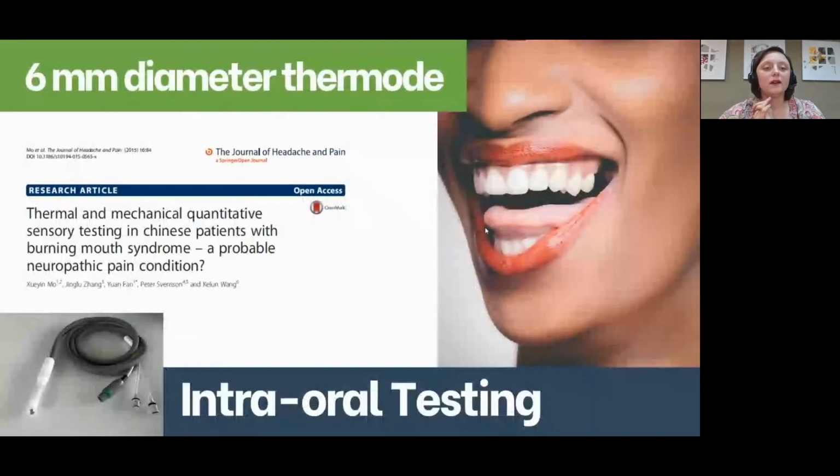The next one is the 6 millimeter diameter thermode. You can see it here in the picture. Some of you may recognize it as an intraoral thermode. With our previous devices, this is what we called it, because it was mainly used inside the mouth, on the teeth and on the tongue. And this paper shows the use of this type of thermode inside the mouth, on the tip of the tongue and the mucosa of the lower lip in burning mouth syndrome patients.